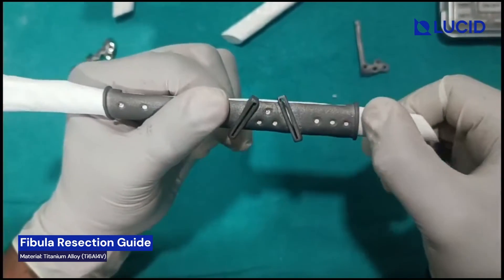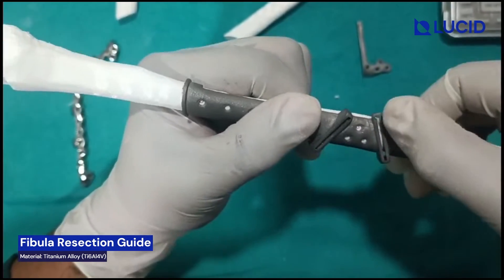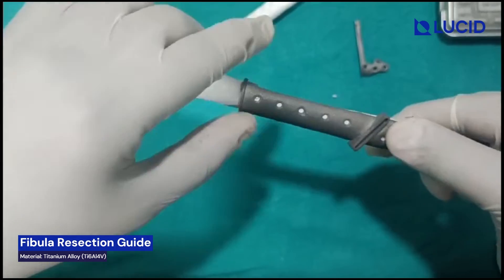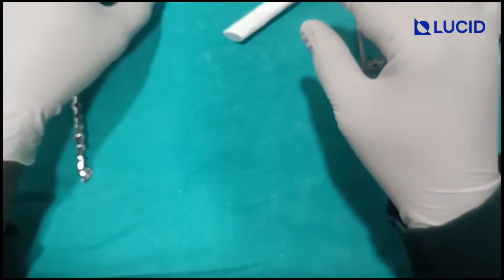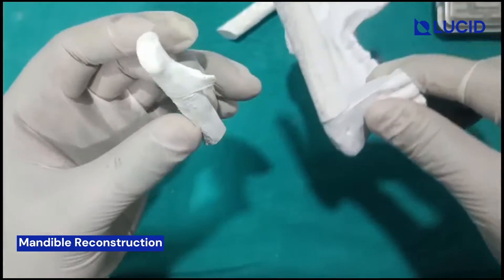When this is done, you can use 2mm screws at any two or three locations to fix the guide and do the first osteotomy from this plane, from this edge. Second from here, third from here, and fourth from here. With this you will get two pieces — this one as well as this one. This is the first piece and this is the second piece.